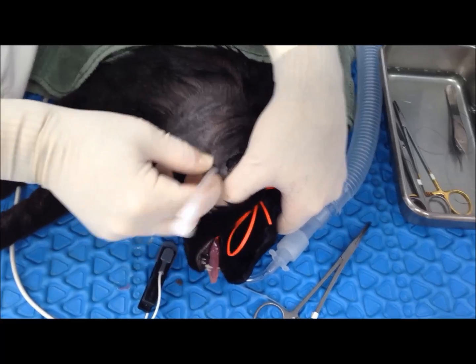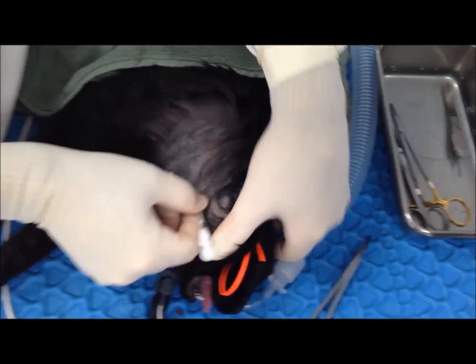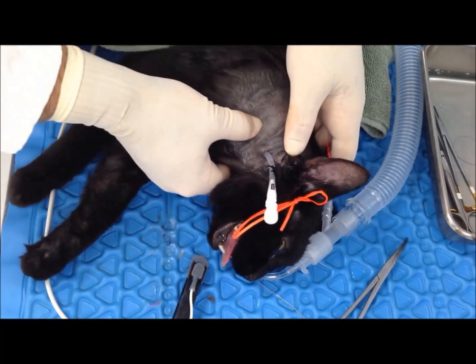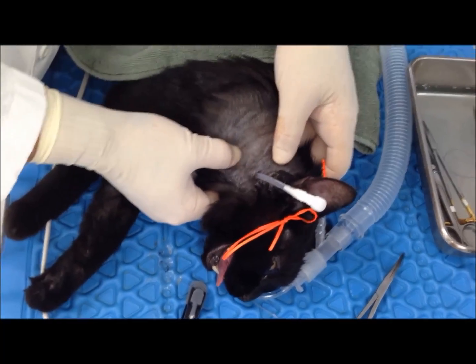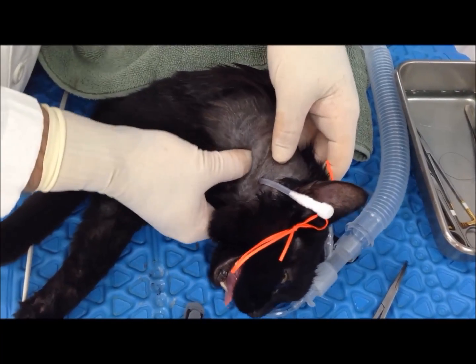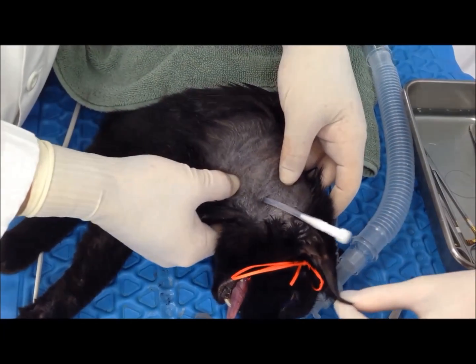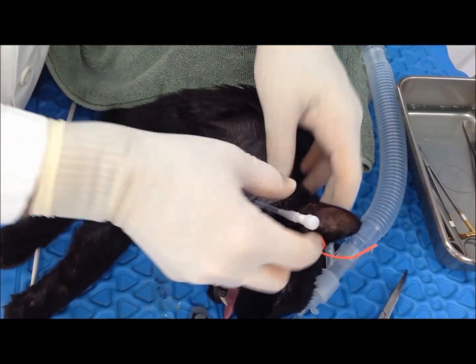Sometimes this can be exceedingly tricky, very frustrating. But if you see that you're in and it's straight down, you can come back here and you can feel the trachea. I'm trying to separate the other two — I'm feeling my tube and then my trachea. So I know that that's good there.